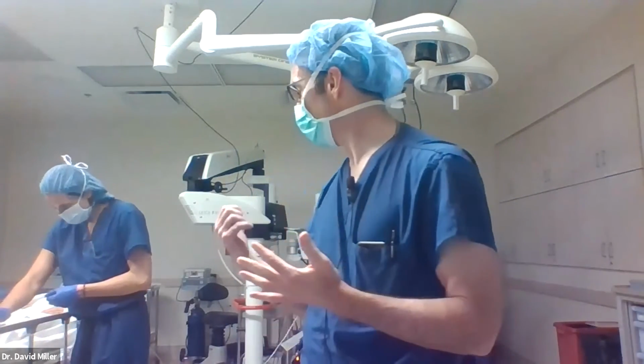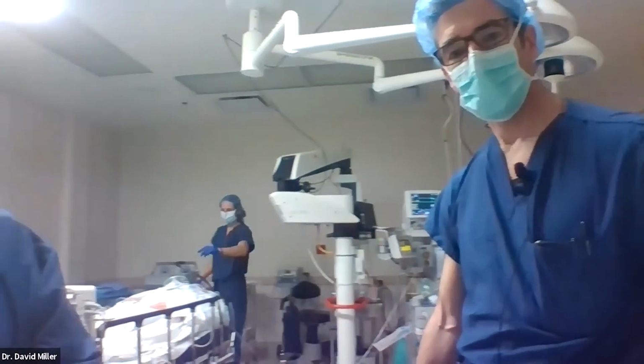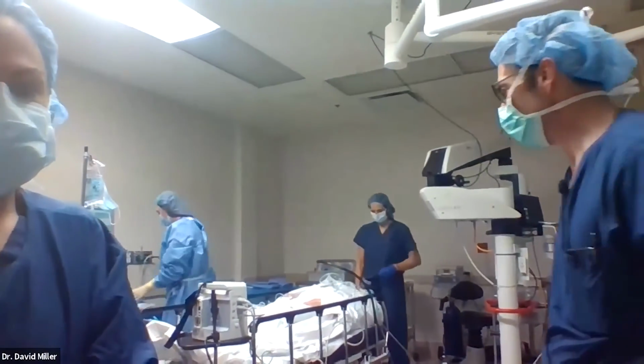I'm going to block the patient, I think, Angelica, ready? I'm going to block the patient so they can prep while we do some more questions and answers. And probably you can just spin this a little bit to see. You can watch us working here at the head of the bed.